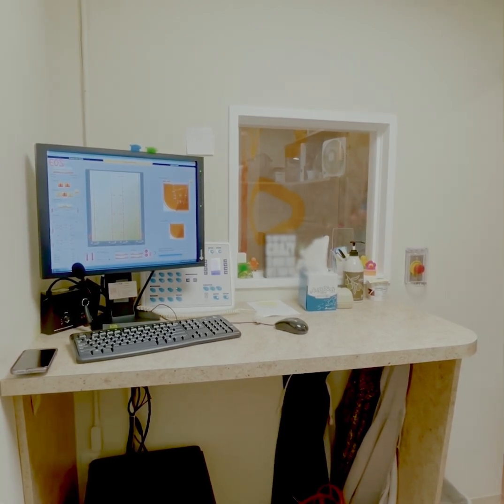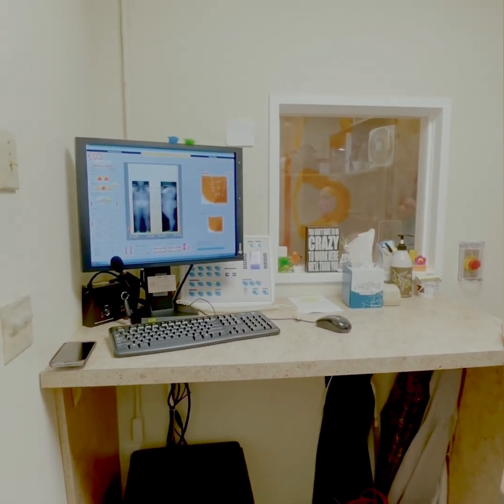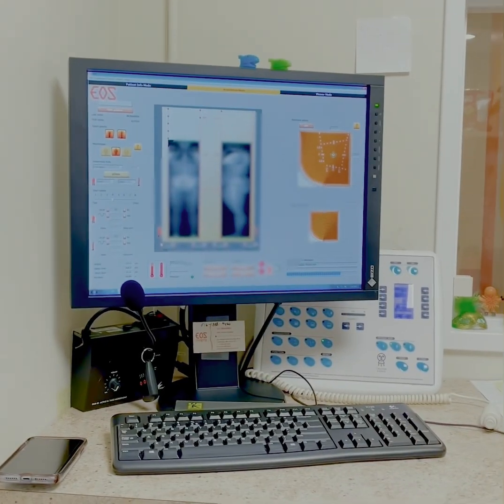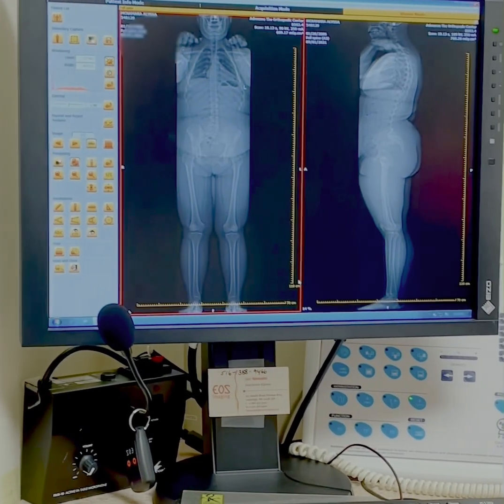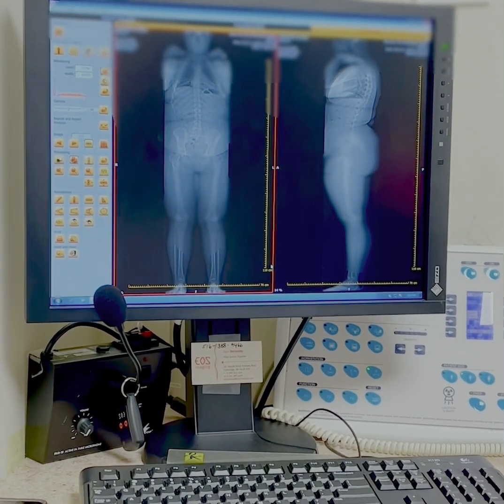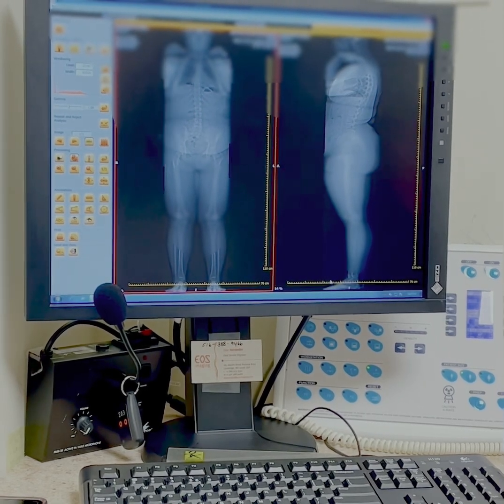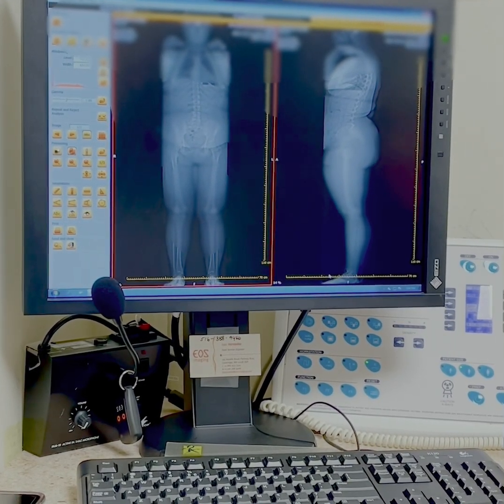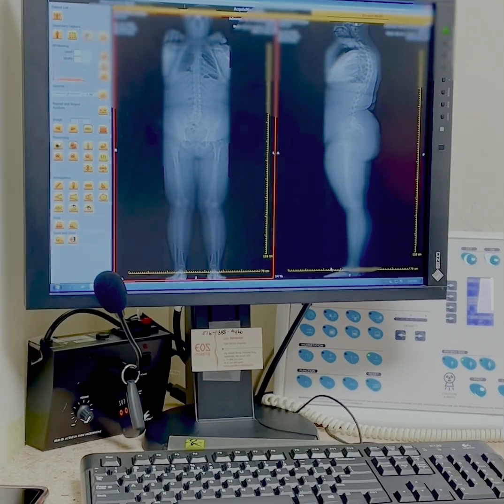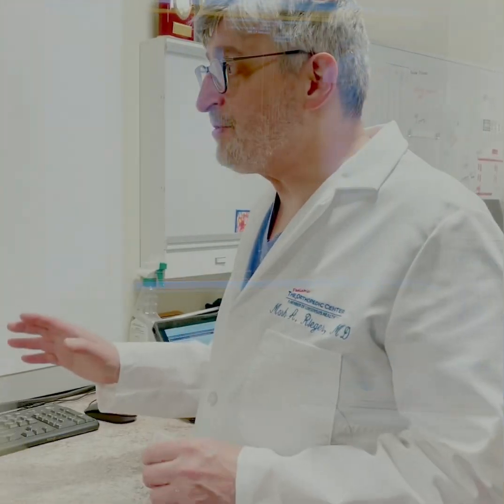And now the study is done, and we just wait for the images to be formatted. And there they are. So those are two images, the front and the side view of the spine. And then they're blown up, and this will be pushed to my station, meaning that it'll be on my image machine, or I should say view box, in just a moment, in which I'm able to take measurements and determine if there's a spinal deformity and how I would treat that spinal deformity. That we were able to obtain.